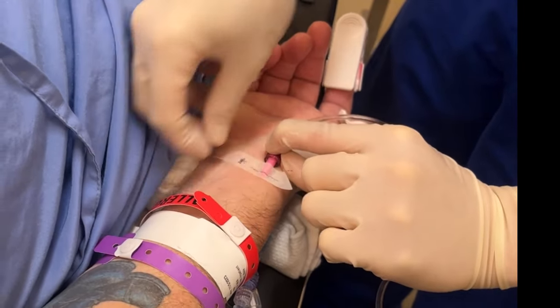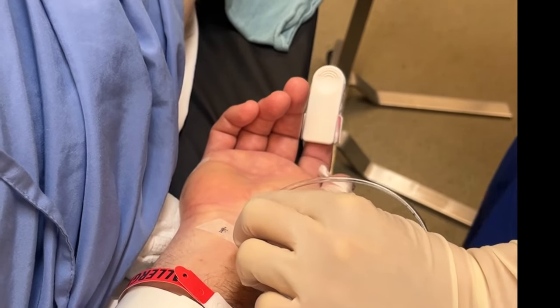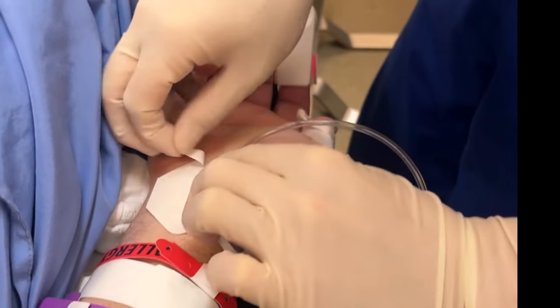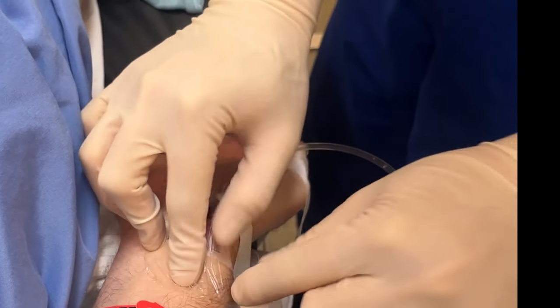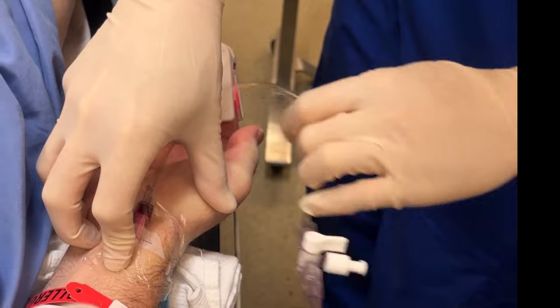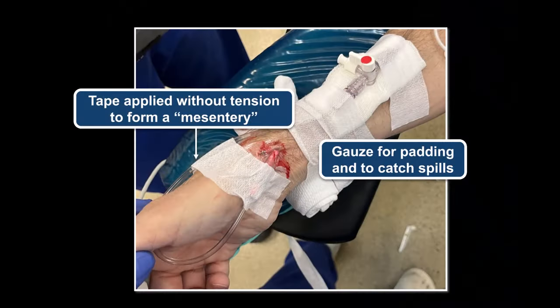Dress with a small tegaderm or any similar dressing available. The key is not to stretch the dressing and compress or kink the cannula in the process. Release the tape holding the thumb to return the wrist to a neutral position before finishing the taping process, so that the cannula will be secured in its natural position, which minimizes issues with kinking and mechanical damping.